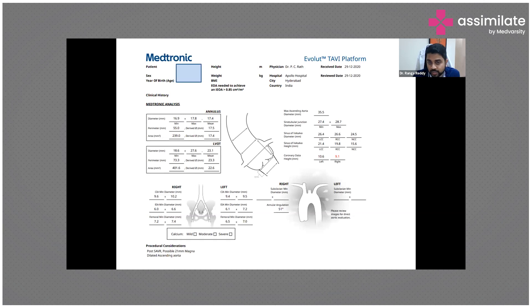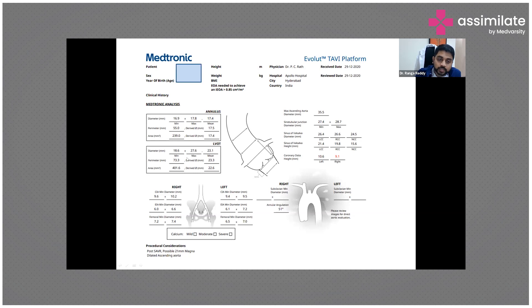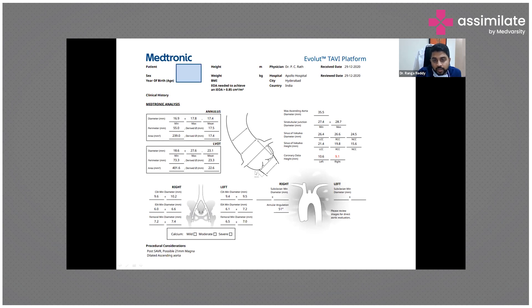This is how we generally assess the CT aortic root: the base plane, the annular plane, the height of the coronaries - right coronary artery and left coronary artery - and the size and area of the annular area, so that we measure beforehand and decide which valve is to be used.